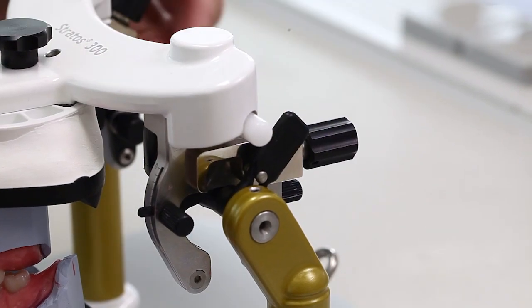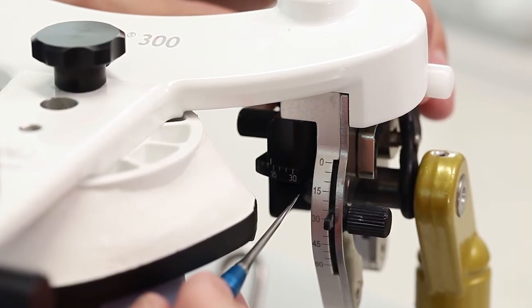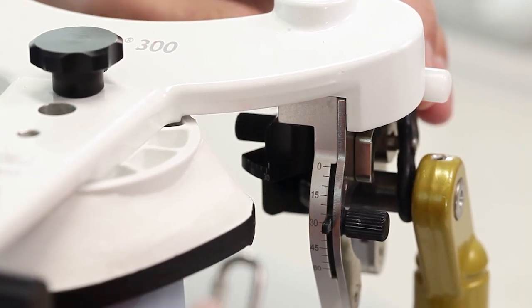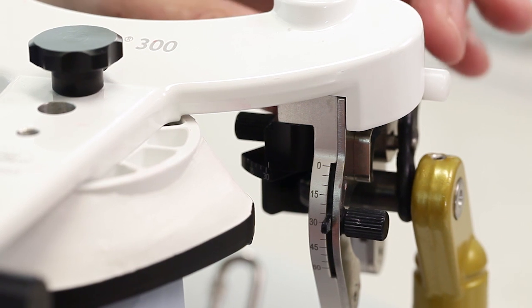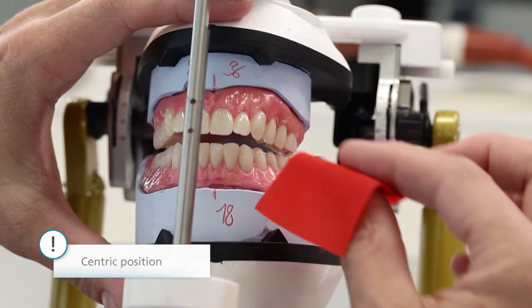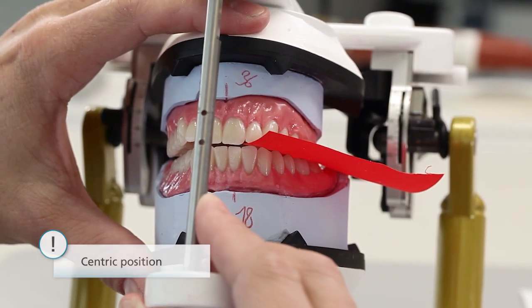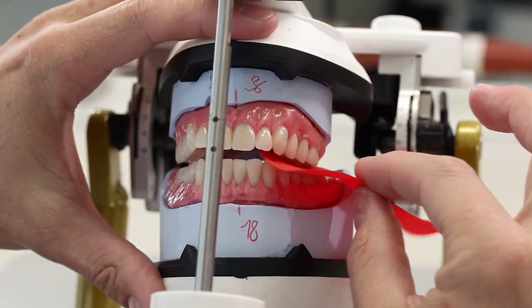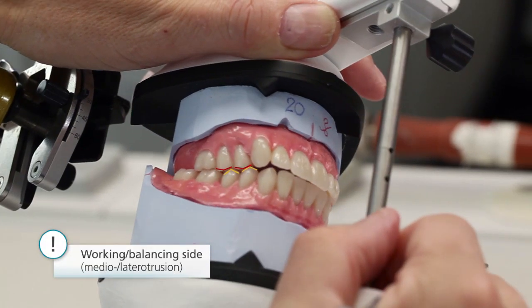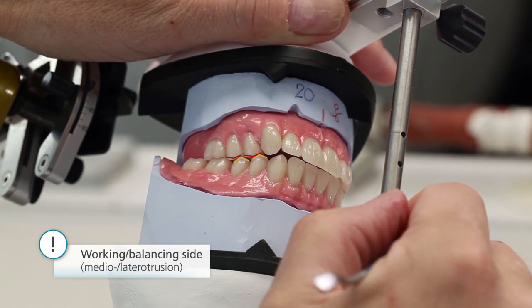Open the centric lock, the Bennett angle and the immediate side shift movement in the articulator. The protrusion angle should remain secured at 30 degrees according to average values. Check the occlusal functions starting from the centric position. Check whether the bucco-mesial surfaces of the upper premolars slide over the bucco-distal edges of the lower premolars on both sides.